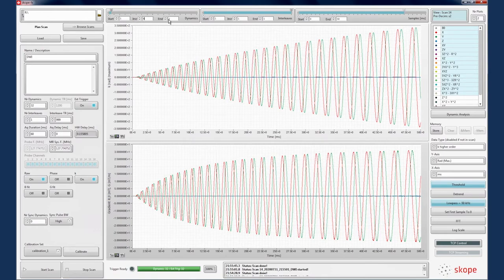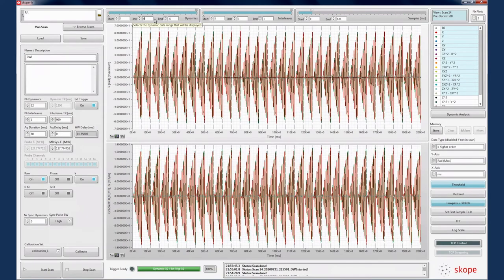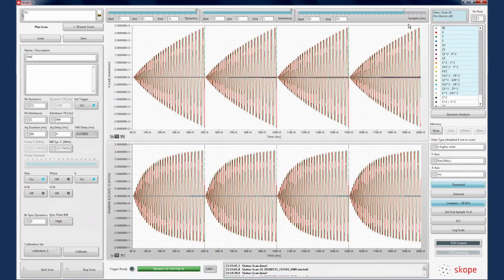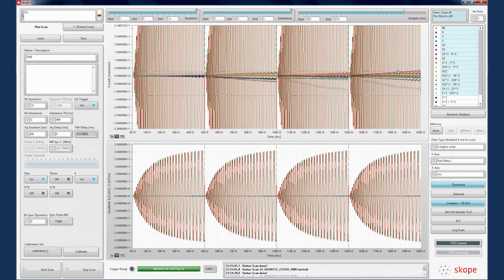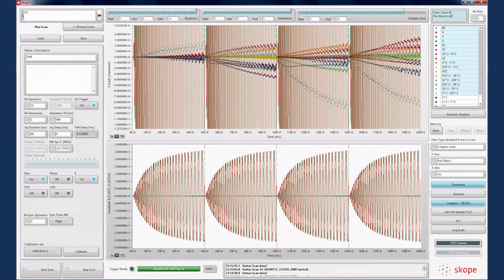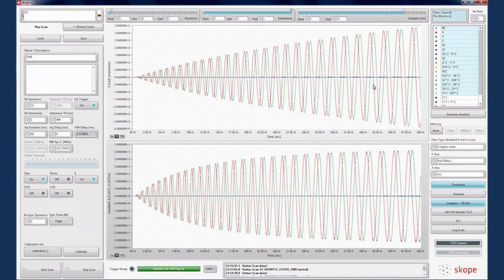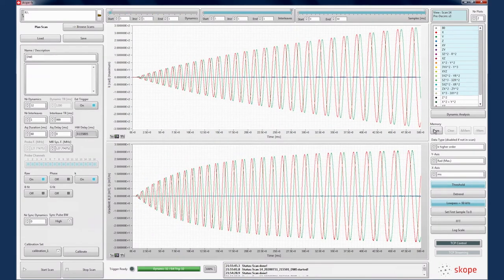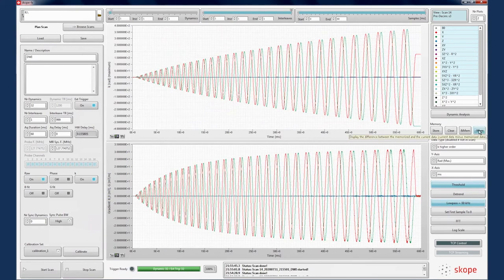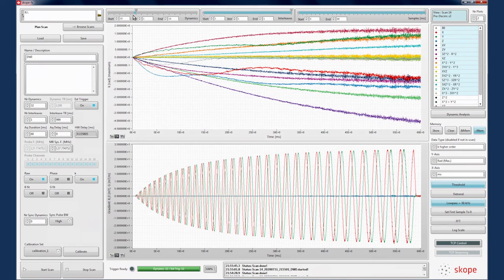The diffusion preparation requires large gradients, which result in long-lived eddy currents. If we zoom in, we can see the difference in the encoding between the non-diffusion-weighted B equals zero acquisitions and the subsequent diffusion-weighted acquisition. By visualizing the difference among these acquisitions, we can directly see the effect of the diffusion preparation.